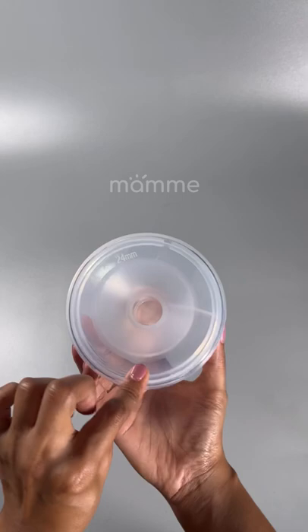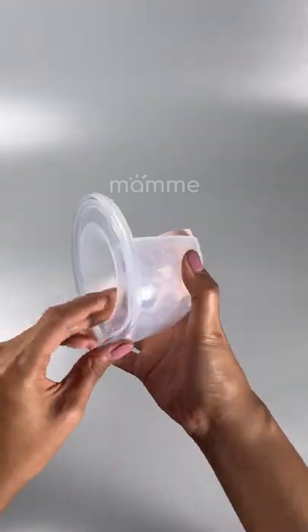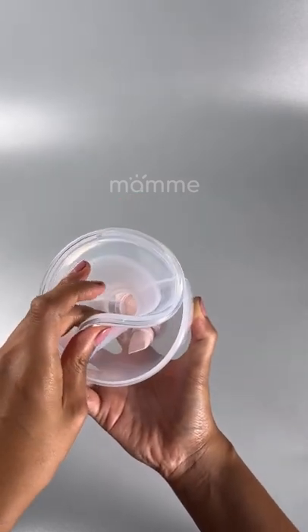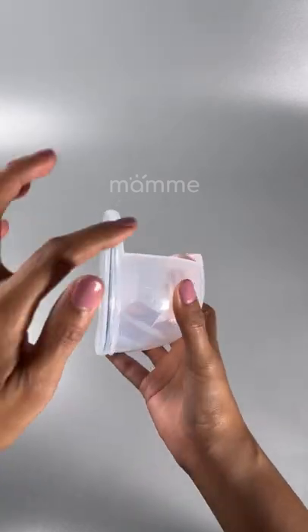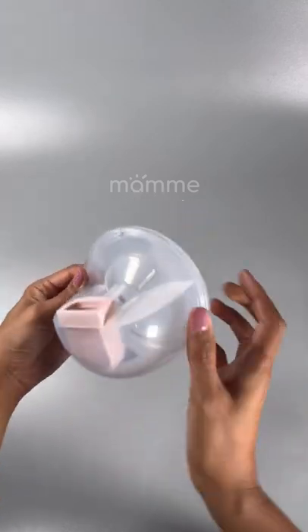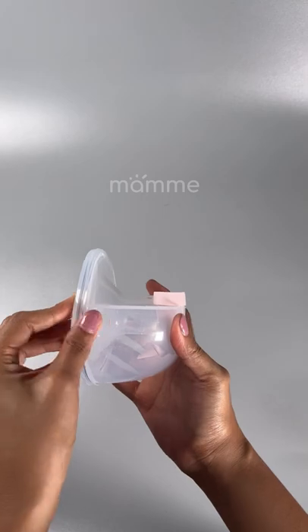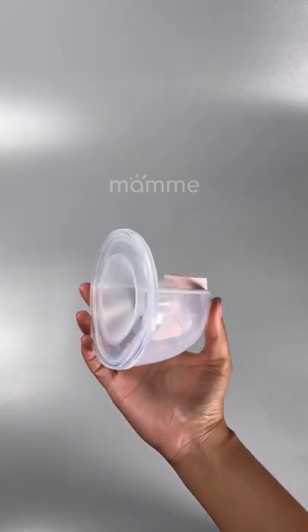Now, for parts naman, you will need to replace these often. For this valve, you need to replace this as often as 1 month. For the membrane, 1 to 3 months. For the cup and the funnel, 4 to 6 months. Alright? Okay. Now, why do we need to change this? Kasi it may cause poor suction kung halimbawa poor na yung cup nyo.